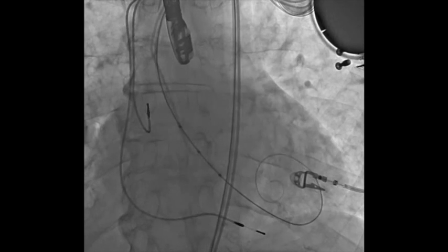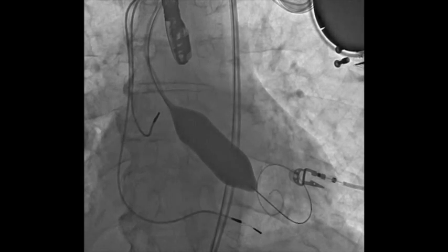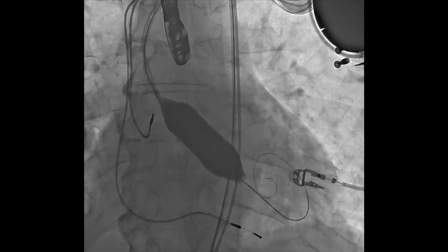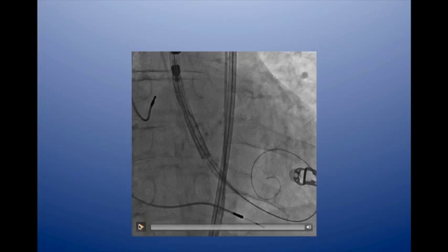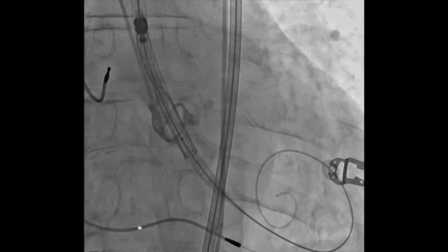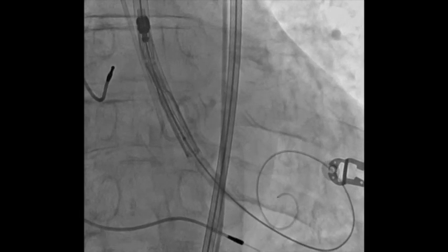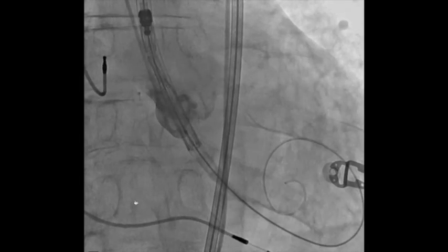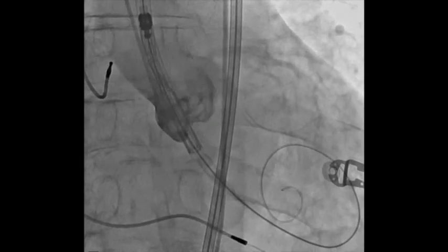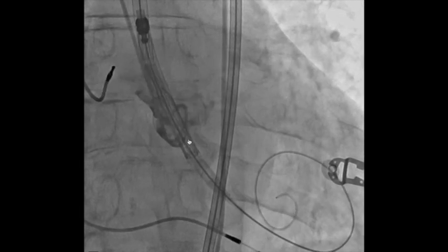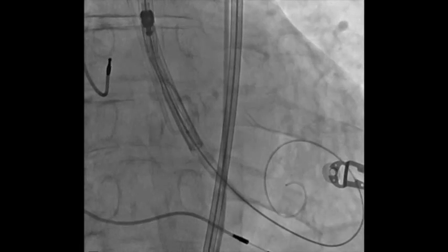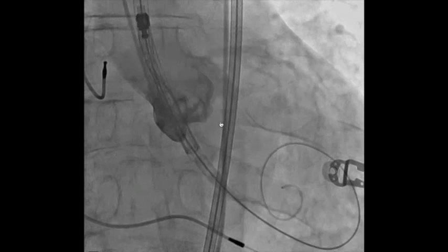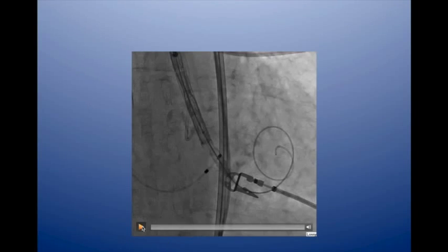You no longer have to pace during balloon valvuloplasty — we used to think we had to, but you can just do it with the ventricle beating; it works very well if you do only one inflation. If you do two, you might have to pace for the second one. This shows the valve in its unexpanded form across the annulus. You can see there's a little aortic regurgitation — probably because we're holding the leaflets open. In a different patient with more aortic regurgitation, if it gets much more than that, the patient might not tolerate it.